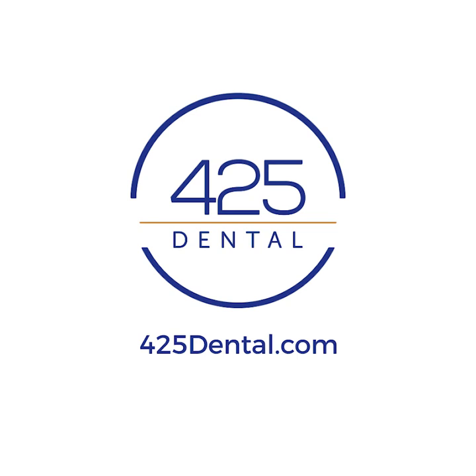At your first visit, we will place attachments on your teeth. These clear composite bumps are programmed with different shapes to help guide your teeth into position. Attachments can sometimes fall off, especially if you have any crowns or fillings. If you notice an attachment is broken or missing, it is not an emergency. There is no need to make any additional appointments, but you do need to call or email to inform us. We cannot use your aligner to repair your attachment, so we will need a heads up in order to prepare to repair at your next scheduled visit.